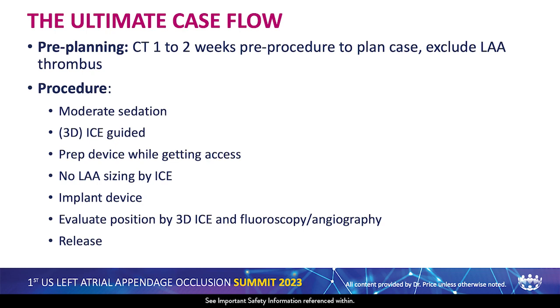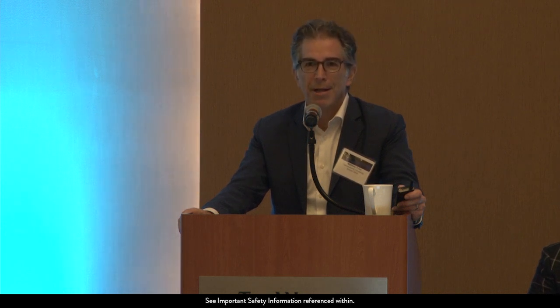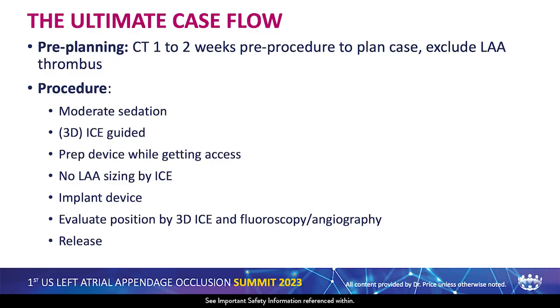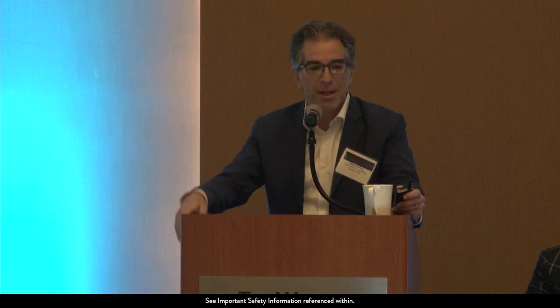Prep the device while getting access. I don't size the LA at the time of the procedure. I've done the CT. How's it going to change? If anything, it's just going to be a little bit smaller, but maybe that's actually incorrect when the patient is volume loaded. I then implant the device, and then I evaluate the position by 3D ICE and fluoro and angio, the lobe, and then the disc, right? And then I release the device.